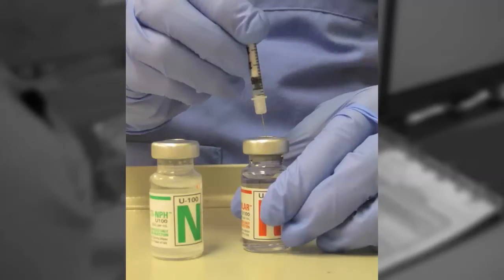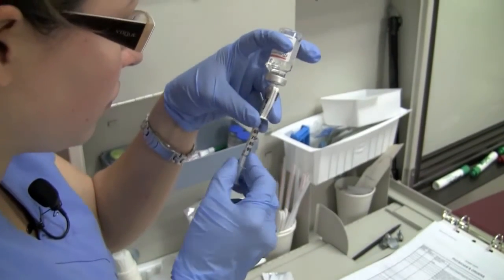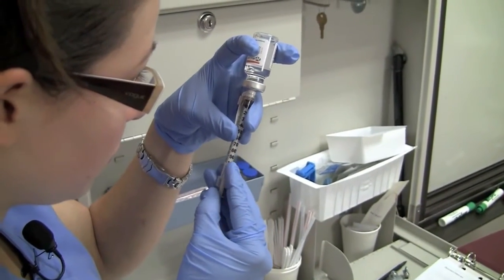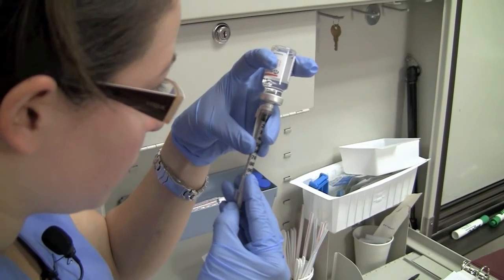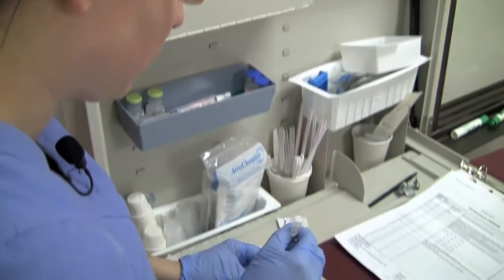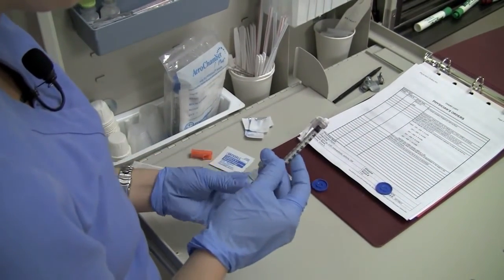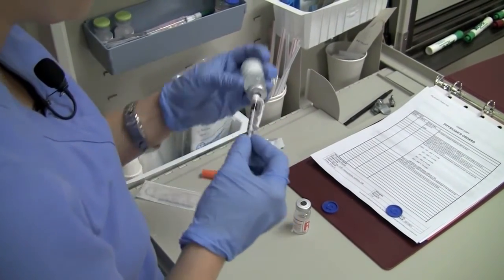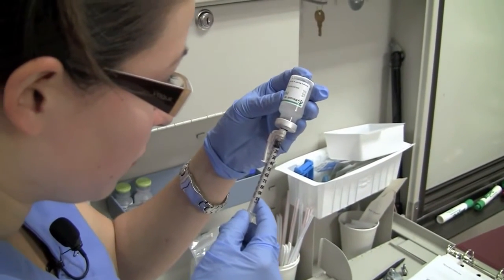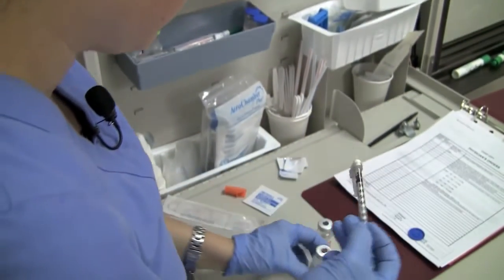Inject 10 units of air into the regular insulin vial and promptly withdraw 10 units of regular insulin. Reinsert the needle into the NPH vial and withdraw 30 units of NPH. Be careful to withdraw only the ordered amount. If excess medication has been withdrawn, discard the syringe and begin again with both insulins.